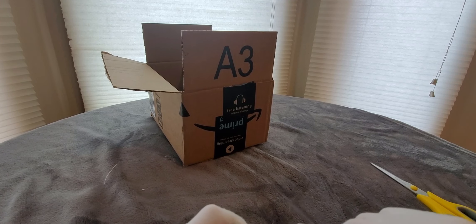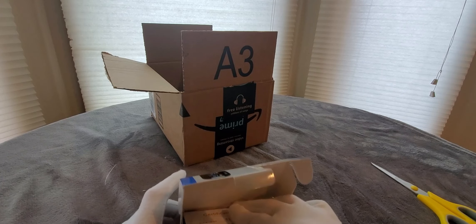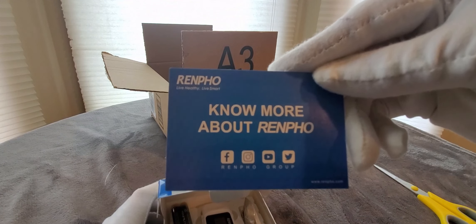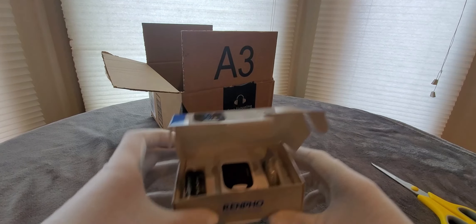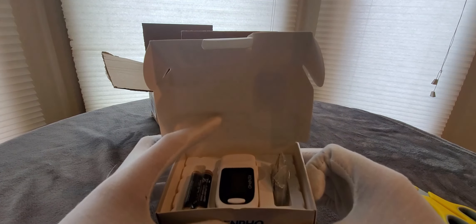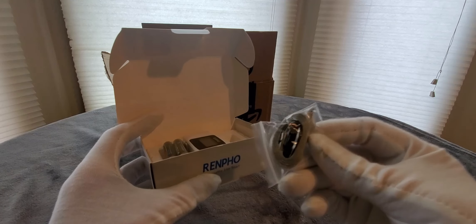Low power consumption, eight-second shutoff, small in size so you can take this anywhere — travel size — you never know once everything starts opening back up. Cool. There's a certificate to let you know it's legit, got the manual, and you can always find them on their social media outlets right there. Alright, let's take a look — this is what the box looks like inside.